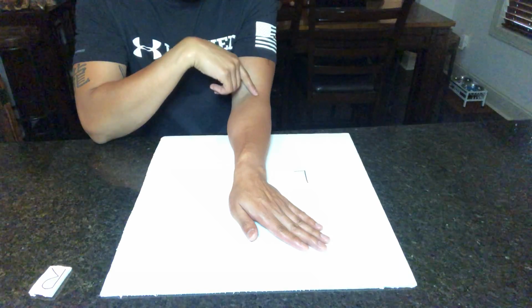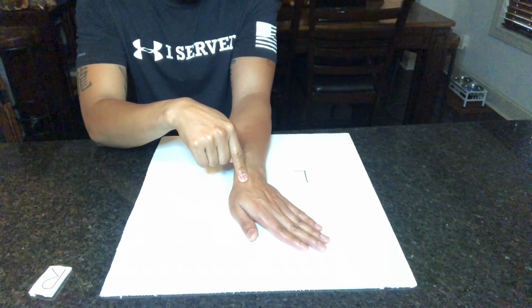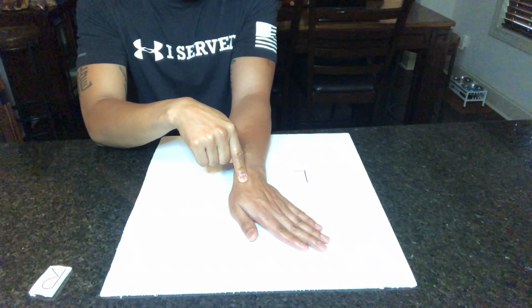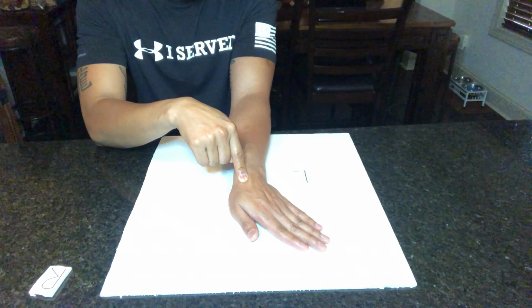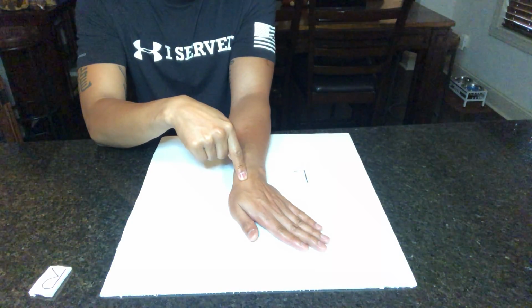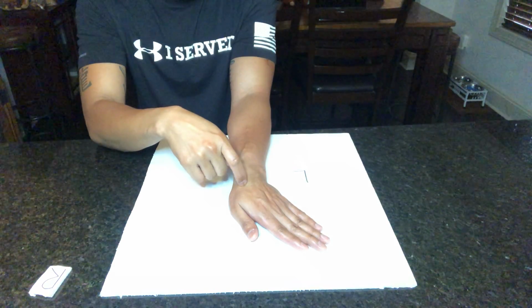The central ray is actually going to be perpendicular to the scaphoid. Something to note with this particular projection, it is also normal to use a 20-degree tube tilt toward the elbow in order to capture this projection. Anatomy here, obviously we're looking specifically for the scaphoid bone.